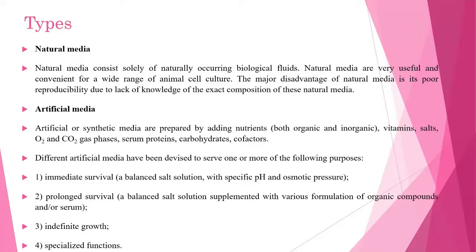You know that the culturing process is another process where you have to macerate the tissue and allow the cells to release into the solution, and that extract is what you will culture. Then for prolonged survival, a balanced salt solution is supplemented with various formulations of organic compounds or serum. In case the culture is going to take a little more time, this balanced salt solution can be enriched with some more compounds before you go in for the actual culturing process.